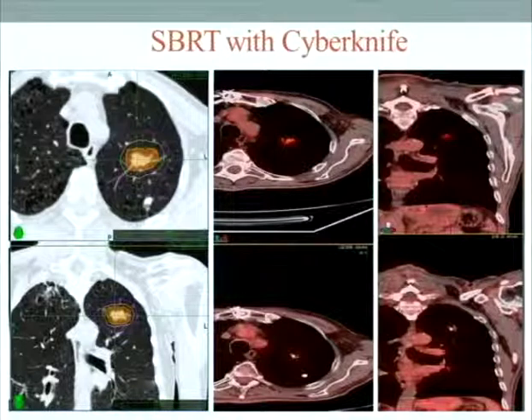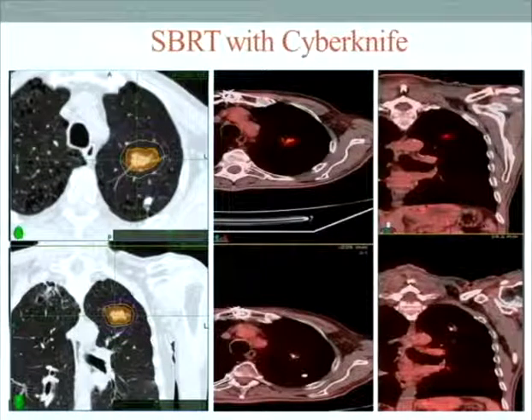And this is an example of a patient that we treated. You see the peripheral lung tumor away from the central structures, of the appropriate size, that received 60 gray. By the time you get to the blue line, only about 1/3 of the dose is there. So you see a sparing of the normal structures, with very little dose in the contralateral lung. This is the PET scan pre-treatment. You can see an active lesion here. And post-treatment, you see not only is the lesion not active at 1 year, but it also has not increased in size. Control rates for the target lesion that we've seen are between 90 to 95%.